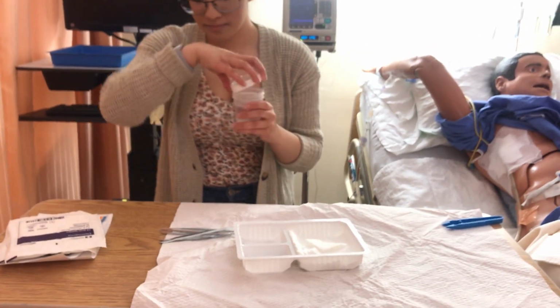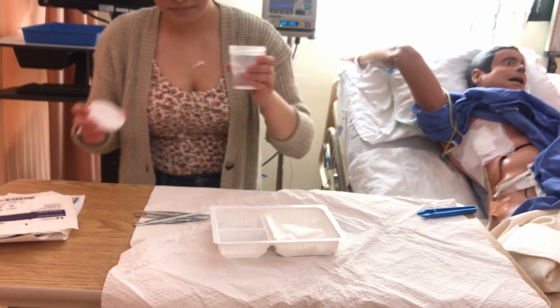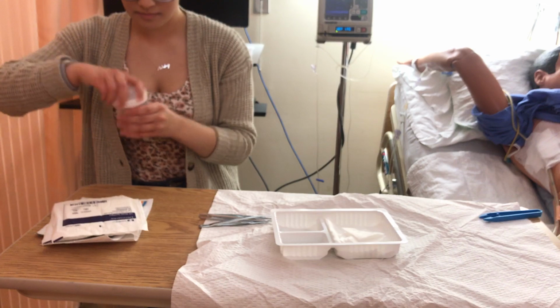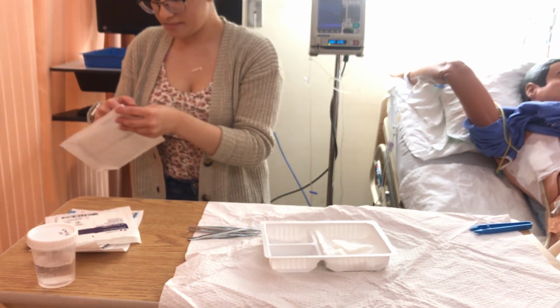Demonstrating how to administer TPN via central line and doing trach care and safety check for trach. So we have Fred Frederickston. I'm just going to pretend we're going to add in some TPN right now, and I'm going to check my bag for my TPN.